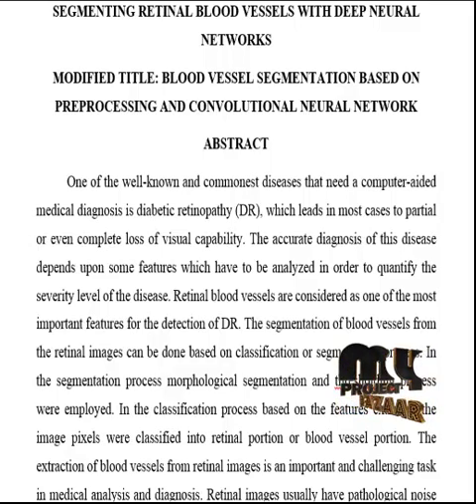One of the well-known and commonest diseases that needs computer-aided medical diagnosis is diabetic retinopathy, which in most cases leads to partial or even complete loss of visual capability. The accurate diagnosis of this disease depends upon some features which have to be analyzed in order to quantify the severity level of the disease. Retinal blood vessels are considered one of the most important features for the detection of diabetic retinopathy.